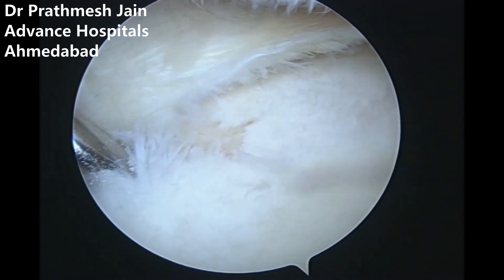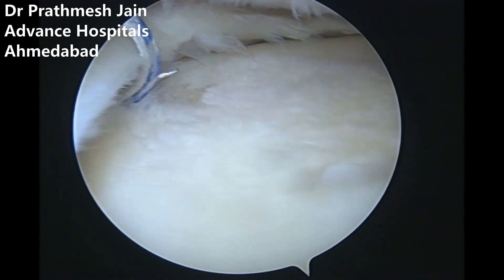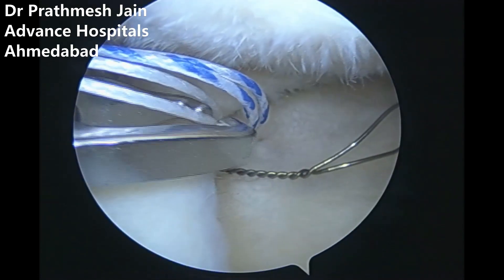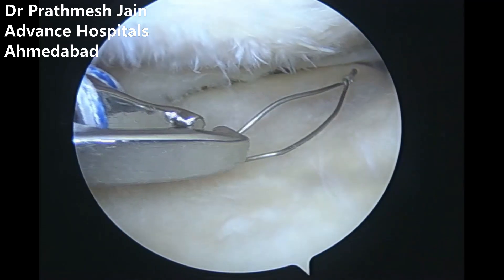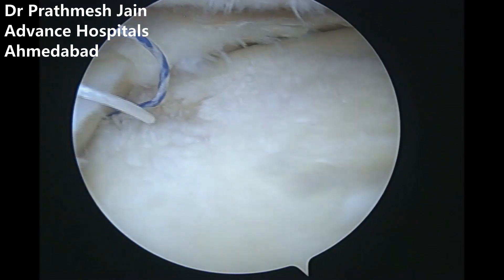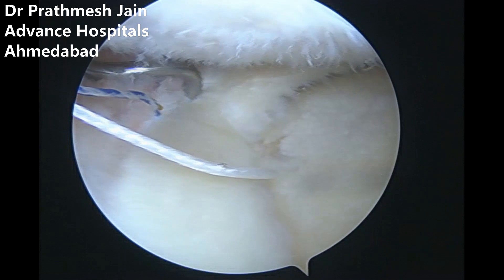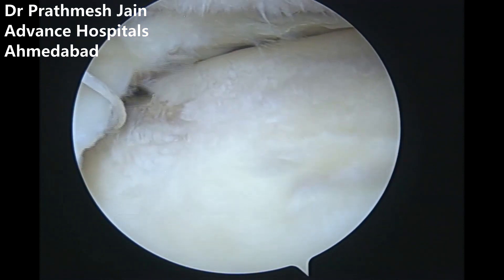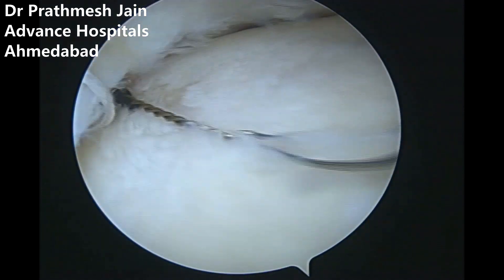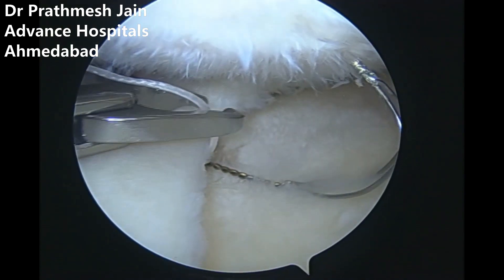We then use our special suture passers to pass the sutures through the meniscus fragments. All four suture limbs from this anchor are passed sequentially using an ideal suture shuttle and Chia passers — one by one, every suture is passed, leading to good purchase of the meniscus. All four sutures are sequentially passed from the first X-fix anchor, which is placed almost at the level of the chondral defect.